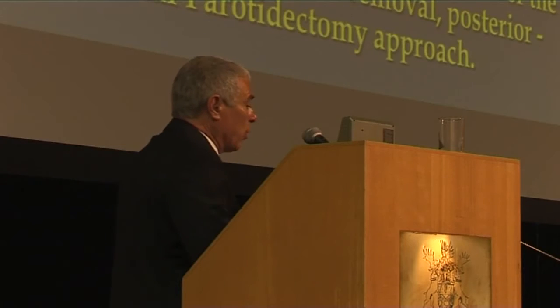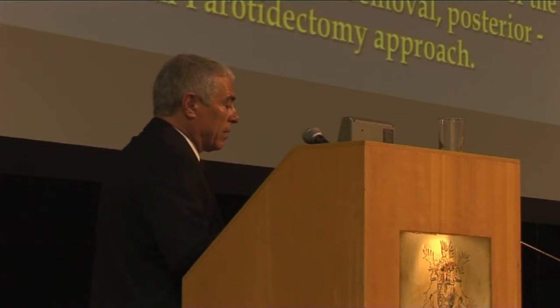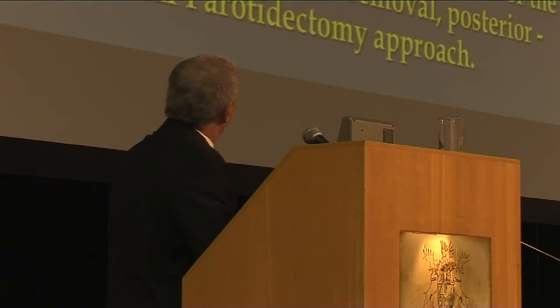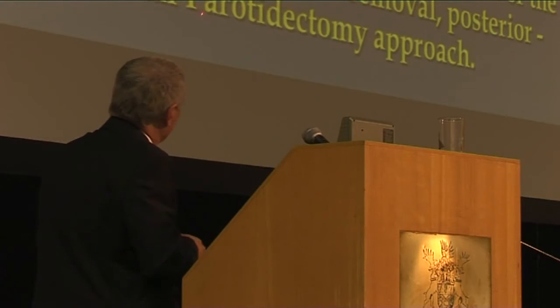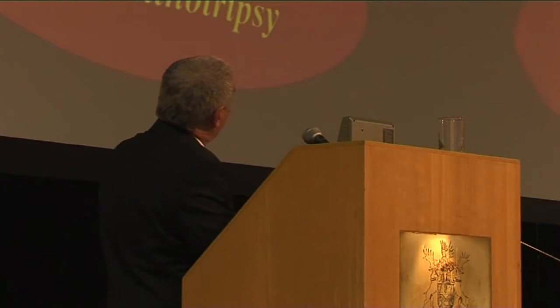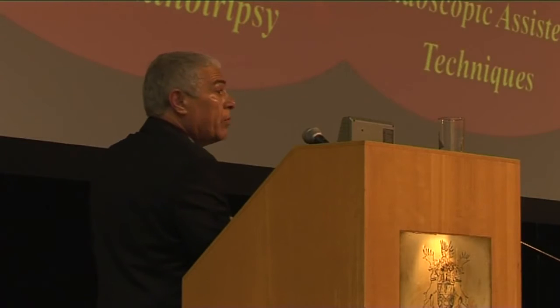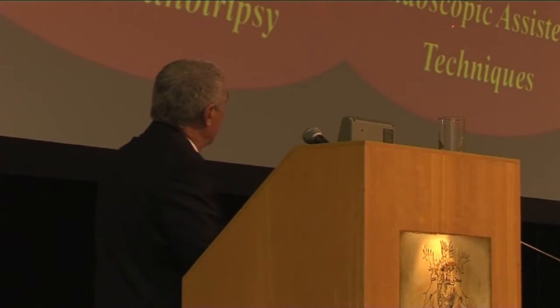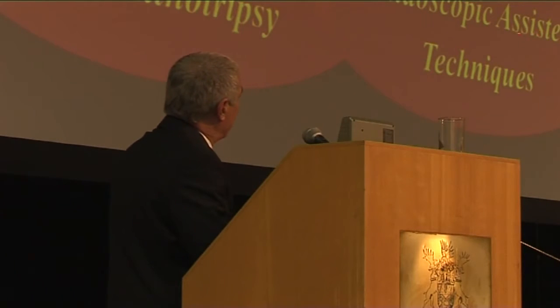Till a few years ago, the only option for parotid lithiasis was, if the calculi is till the curvature of the Stenson duct, intraoral removal. Posterior to this region, superficial parotidectomy approach was the only option. But nowadays, I am proud that we can perform most of the parotid stones with minimal invasive techniques, part with pure endoscopic technique, part with extracorporeal shockwave lithotripsy, and part with endoscopic assisted techniques.